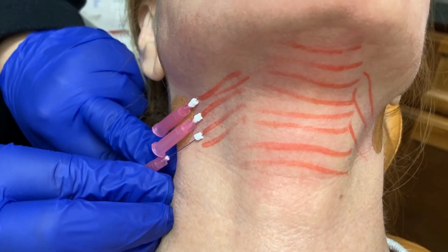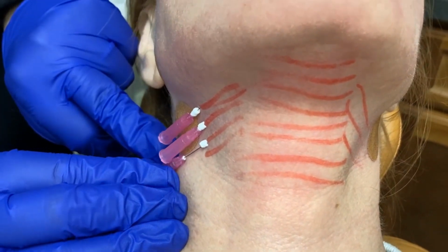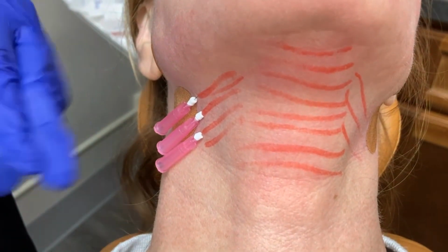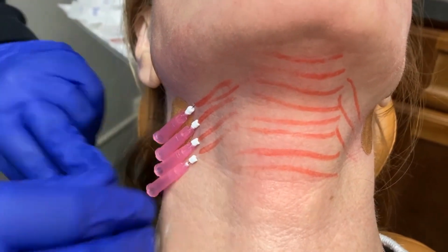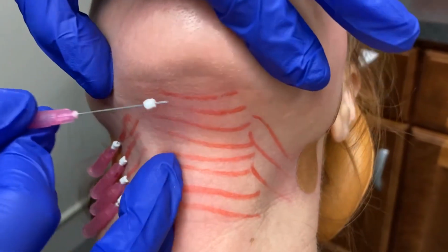Polydioxanone threads are a suture material that is slowly absorbable, and over time it starts to dissolve. It takes about 3 to 4 weeks for that process to really start. And the body's natural reaction from an aesthetic point of view is to build collagen around it as it is being absorbed.